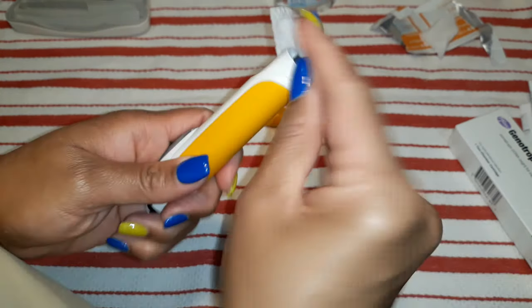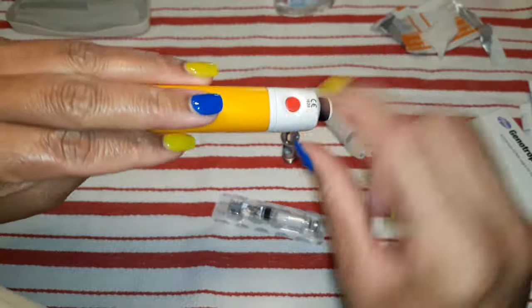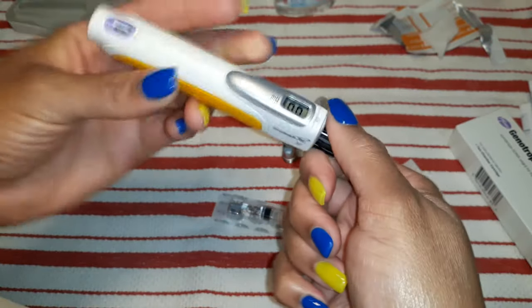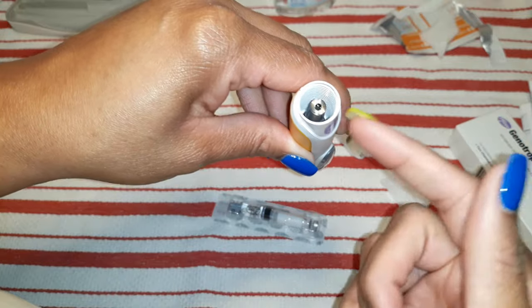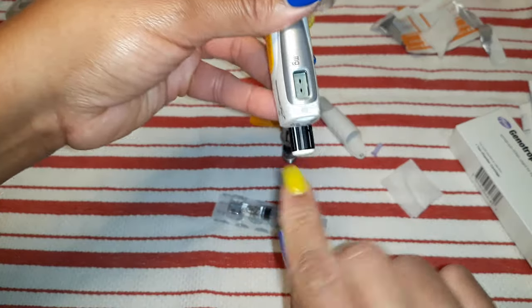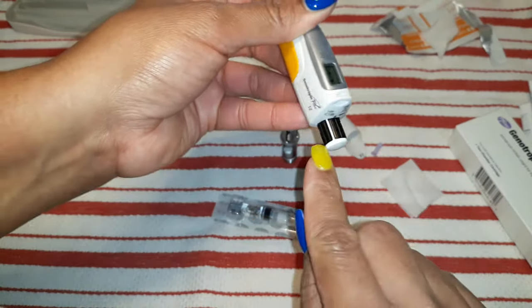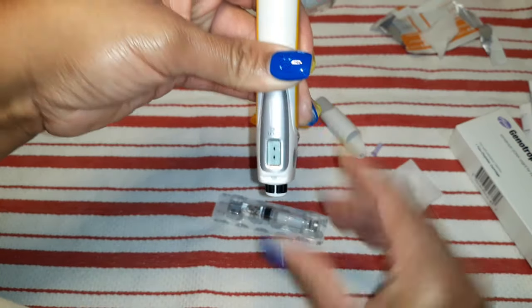Then I'm going to get another alcohol wipe and wipe down my Genotropin. Also, this has to stay refrigerated. I'm going to push this red button to pop this button out, and then dial it all the way down. What that is doing is moving this — I guess you could say it's like a hydraulic — it's pushing it down. Once I get down to the bottom where it won't turn anymore, I want to align this line here with this line here, and push it back up.